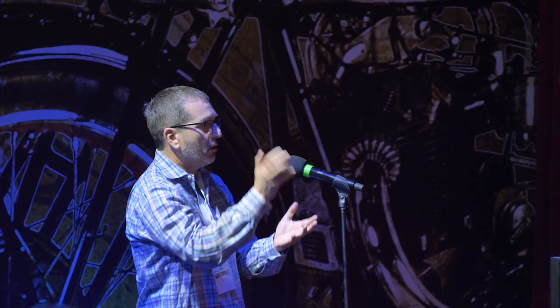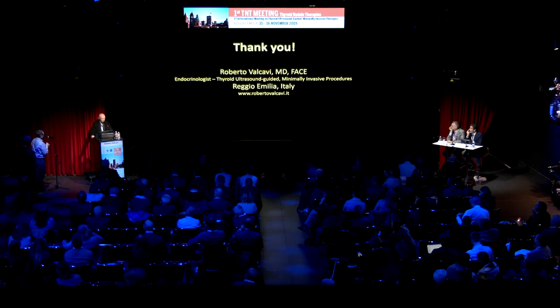Thank you, Dr. Valcavi. I have 2 questions. One, is there any head-to-head study between putting alcohol and draining the alcohol versus just putting alcohol, 1/3 of the volume, and leaving the alcohol inside of the nodule? As far as I know, no. There are different techniques. I recommend my technique because it's effective.